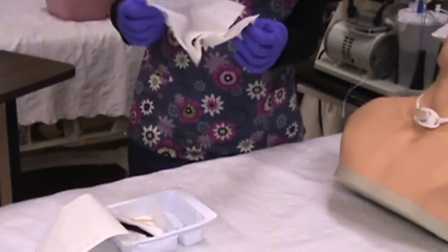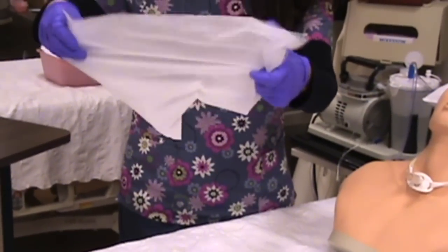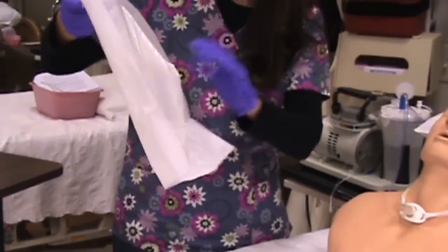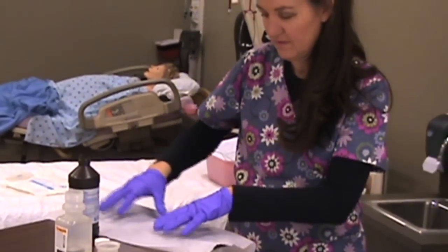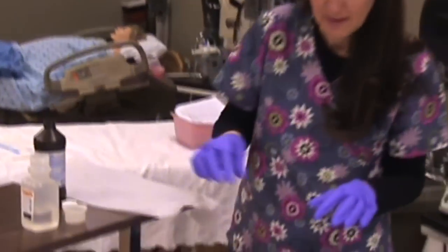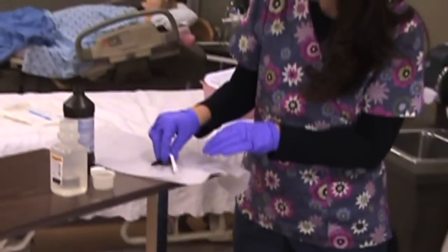I have a sterile drape here that I'm going to put the shiny side down, so I'll set it on my table. Remember, this is sterile right here, and I'll take my stuff out so I can see what I have.